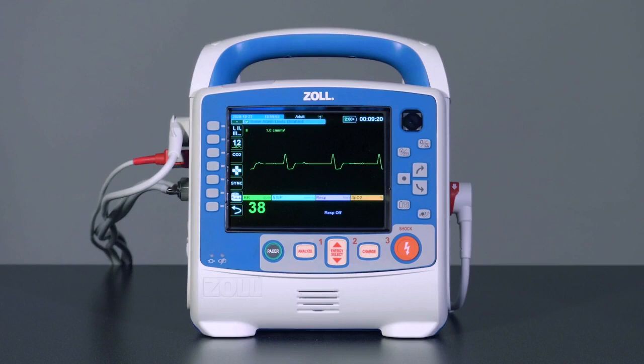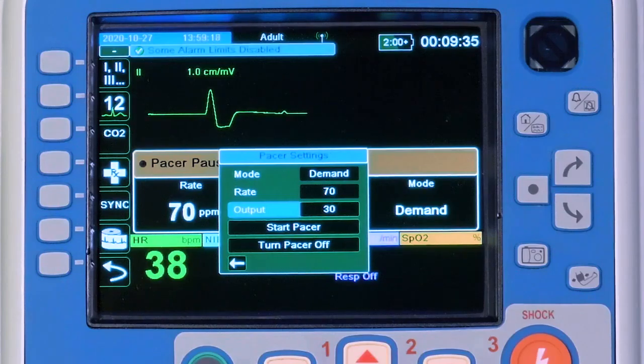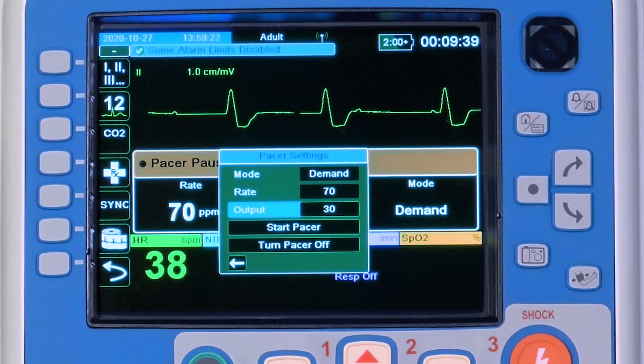After the 4-lead ECG cable, ECG electrodes, and Zoll multifunction pads are applied to the patient, select the green Pacer key to open the pacing menu. The pacing menu will appear in the center of the screen. Default settings for rate and mode are configurable within the supervisor menu.